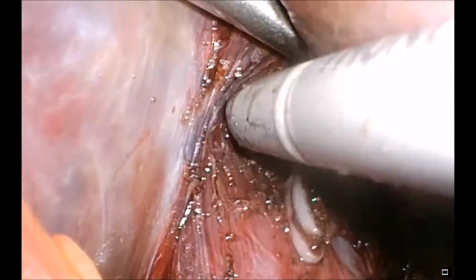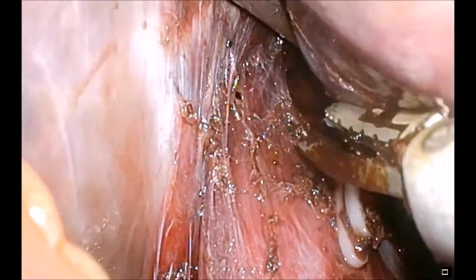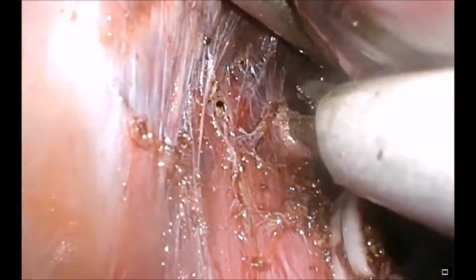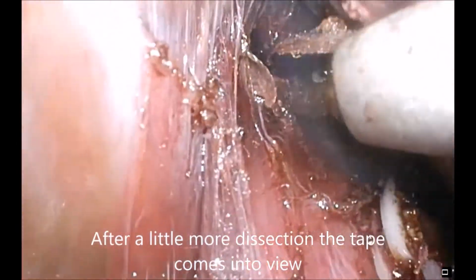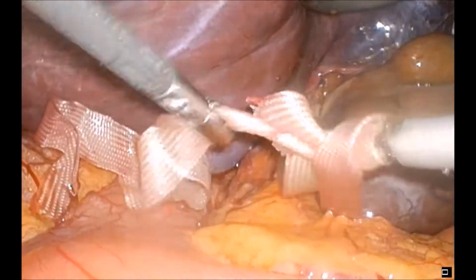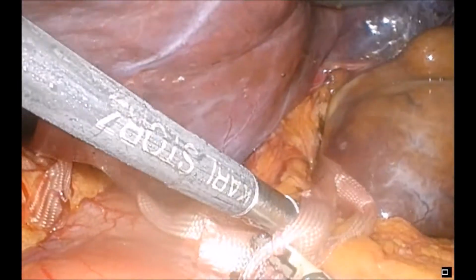You can see that there's a little window of areolar tissue developing just to the left of where the Thunderbeat is, just into that tissue there, and as we take that down we see the tape. So we know that the shunt is below that point now. The tape can now be used for traction.